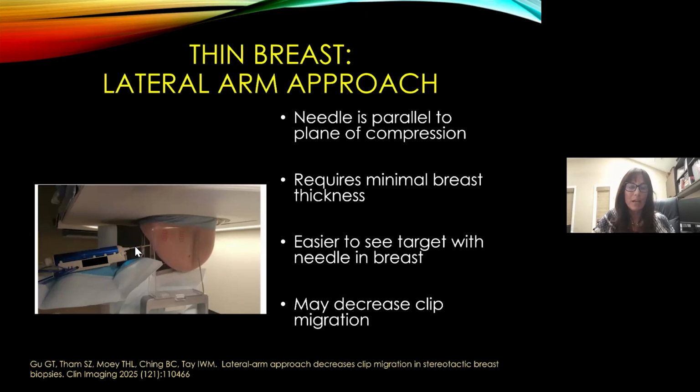I personally have found this a little bit of a challenge in a very thin breast only because I can't get my hand in there. I have to get close enough to the breast to clean off the skin and anesthetize. And sometimes I've just found it a challenge. I asked the technologist to try to place the edge of the breast as close as possible to the edge of the paddle, still with obtaining satisfactory compression.